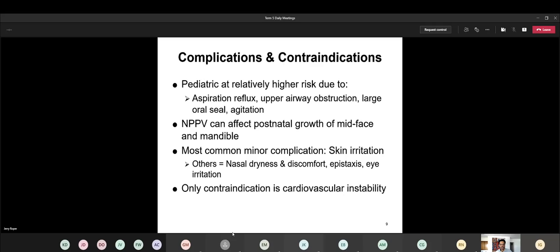And then under the others category here, the drying out of the airway. We use a heated humidification system to try to overcome this problem. But even with the heaters and humidification, that can sometimes still not be enough, and they may complain of being just too dry. The nosebleeds, that's usually related to not enough humidity.